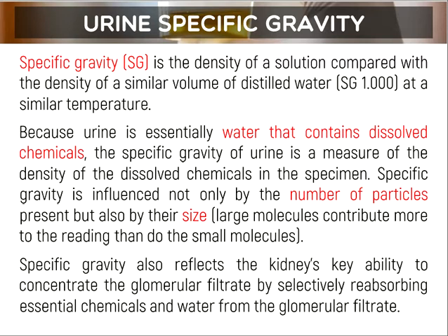It indicates the relative proportions of dissolved solid components to the total volume of the specimen. It is a reflection of the kidney's ability to dilute or concentrate urine.